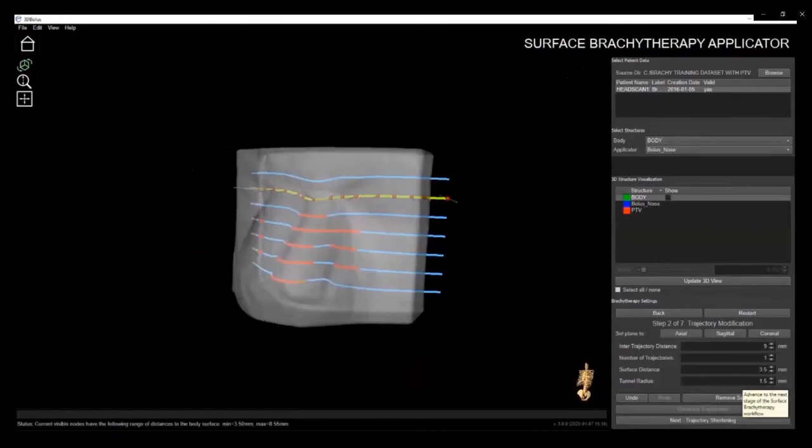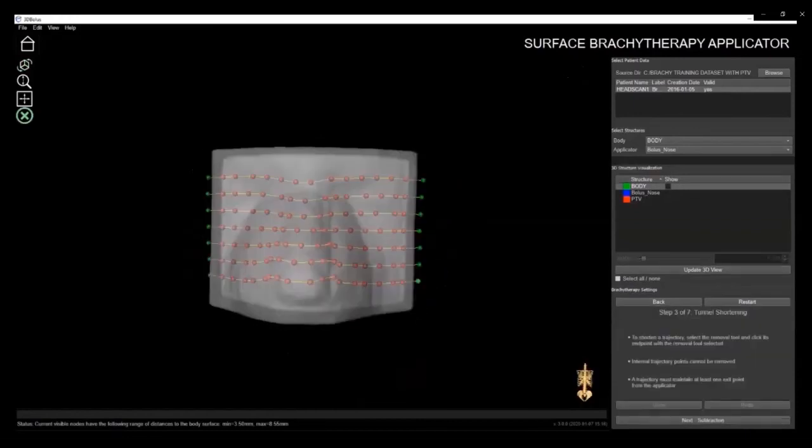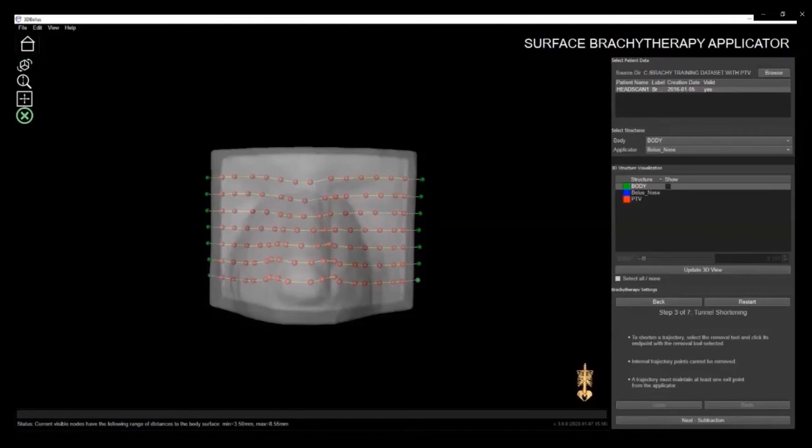The next step is trajectory shortening. This allows you to shorten and stop any tunnel as needed. Again, this was added to our software as a direct result of customer feedback. You simply click on the green node at the end of each trajectory and continue to do that until you're satisfied. Then, click Next Subtraction.